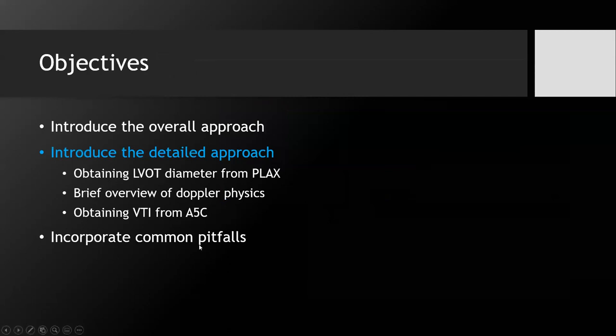You'll probably come to this, but in case you don't, one thing that they told us in the echo course was, this can get you cardiac output, but some of the measurements you make are sort of all that matter to you. And so if not now, something you can comment on is, why do these things that might introduce error if you can just measure the VTI? Oh, okay, so Chris is asking why do we have to measure the LVOT? A lot of people just look at VTI and don't really get the LVOT diameter, so why would they do that? I will address that. And if I don't by the end, let me know.